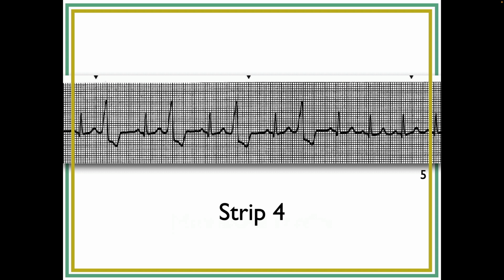It's like borderline bradycardia, at least in the beginning. Oh, that brings up a great question. So what is the underlying rate here? In this case, we can pretty much say what it is, because probably the underlying rate is this, okay? So this looks like about 300, 150, about 75.